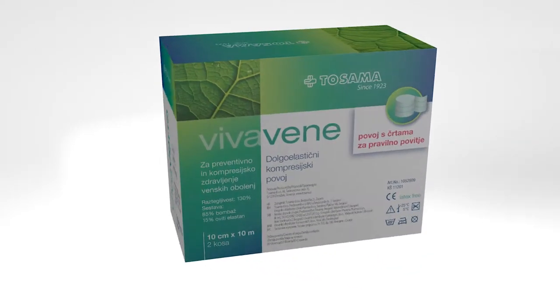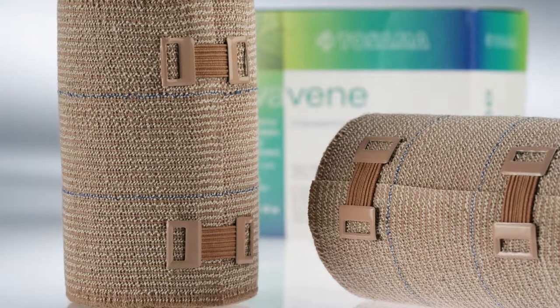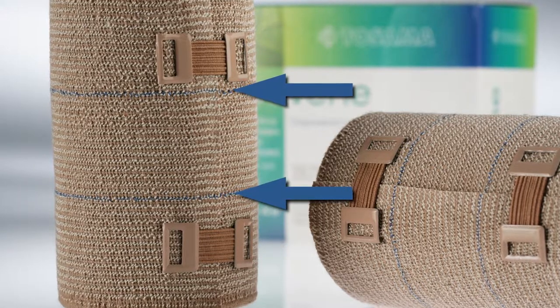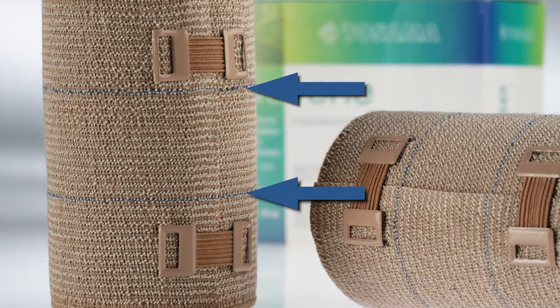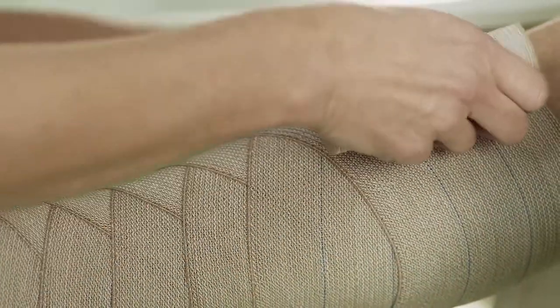A severe compression can cause leg pain. For easier and correct dressing, the bandage has two blue lines that indicate the width of each wrap. In order to properly dress the limb, each subsequent wrap should cover the lower line. If the bandage is properly put on, the blue lines are not visible.